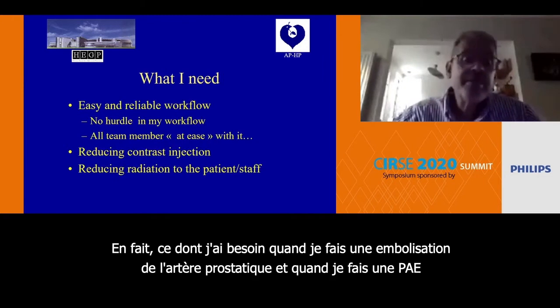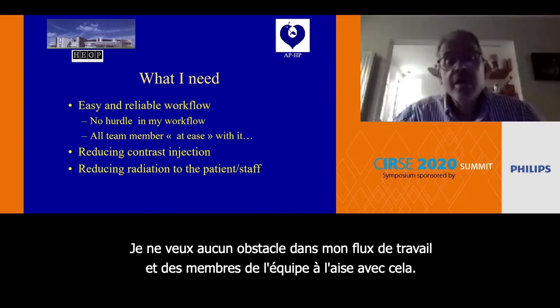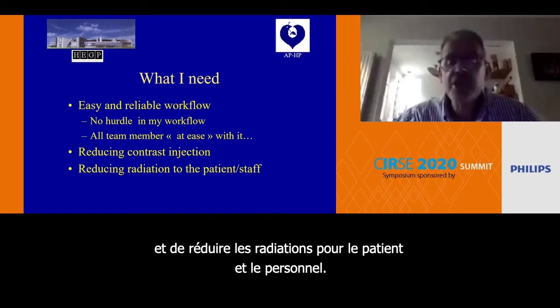So what I need, in fact, when I do prostatic artery embolization, PAE, is an easy and reliable workflow. I need no hurdle in my workflow, and I need that all team members are at ease with it. And I need also something which allows me to reduce contrast injection and reduce radiation to the patient and staff.